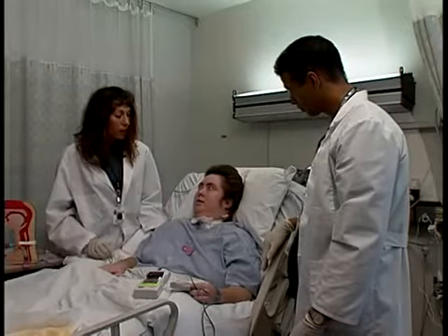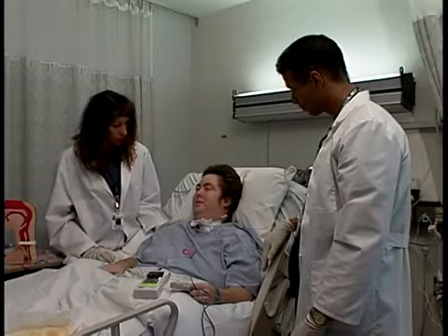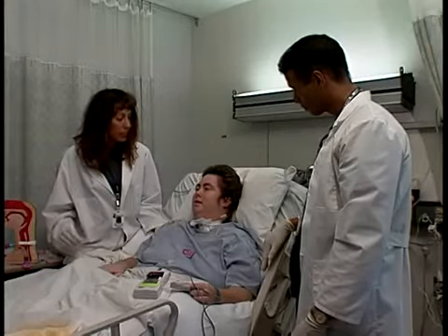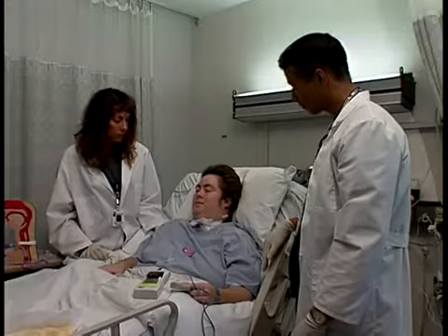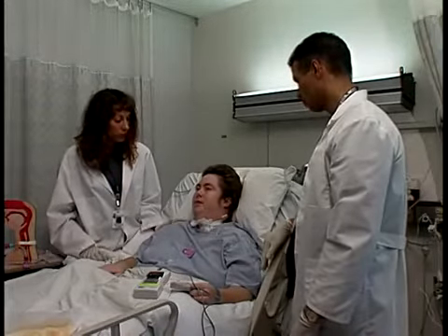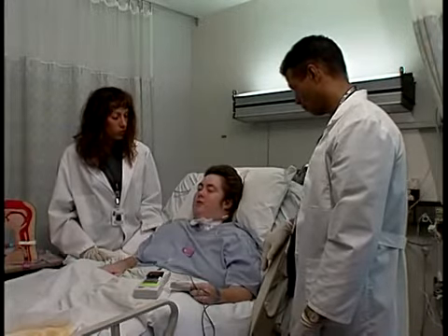Although some patients may be able to exhale adequately, they may not be able to vocalize initially and may require voice assessment and/or retraining. Some patients may require repeated attempts of these steps to become accustomed to exhaling through the upper airway. Once it is determined that your patient is able to tolerate finger occlusion, you can proceed with placement of the valve.